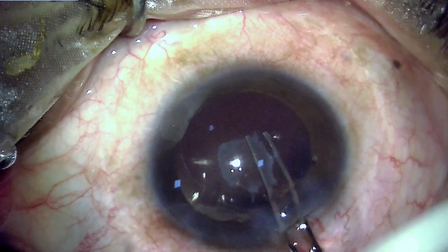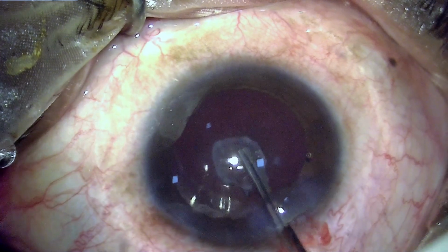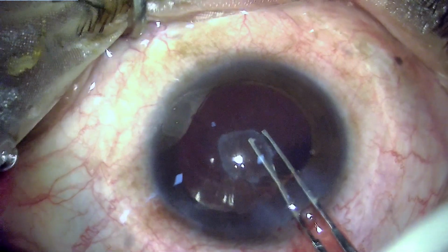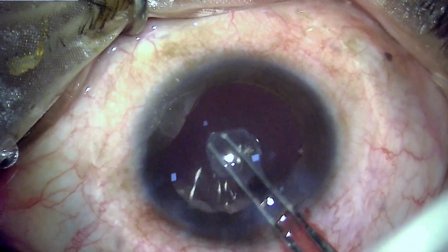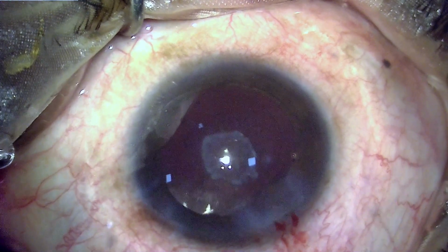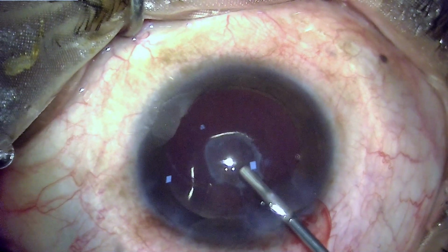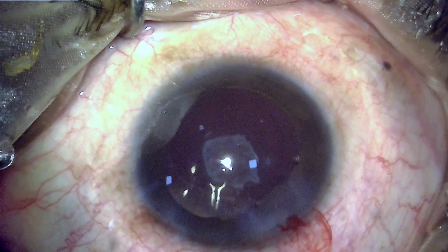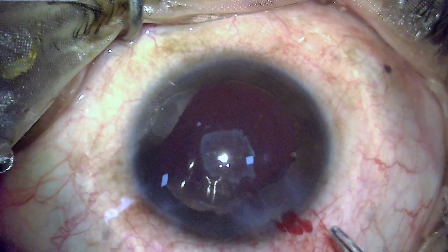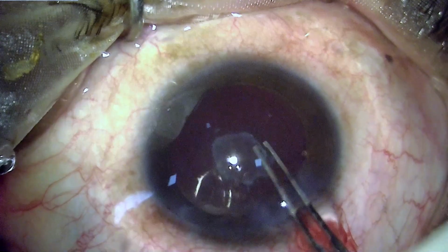So, grabbing one of the edges of this plaque and trying to peel it out, although it's very difficult because the edge is very minute. So I am looking for places where I can grab this plaque and try to peel it away from the capsule. A clear visual access, especially in the central part, is important for a good visual outcome in any cataract surgery case. The same goes with this.